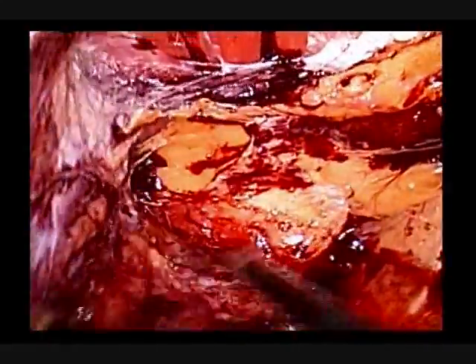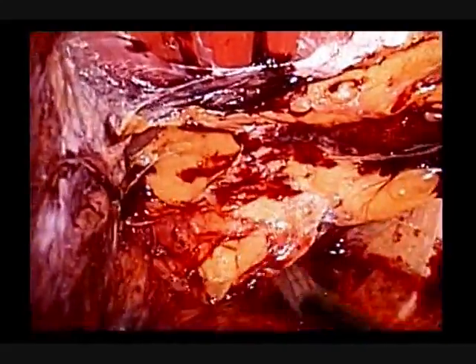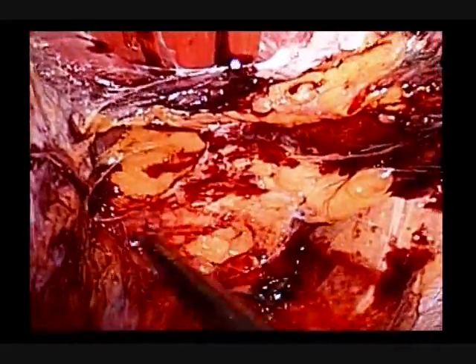Lateral dissection of peritoneum is completed. Please note the extended surgical field accomplished by this technique.